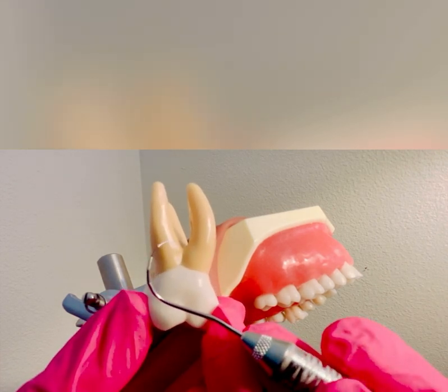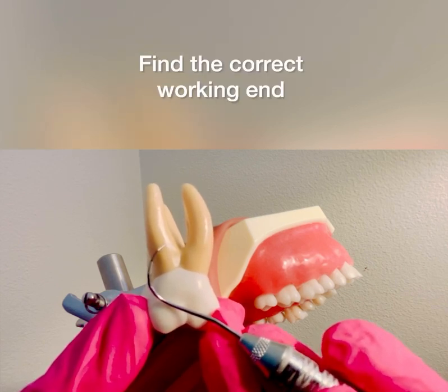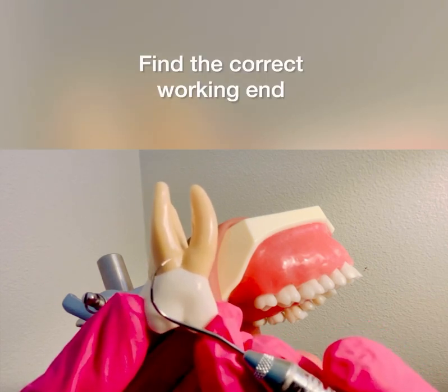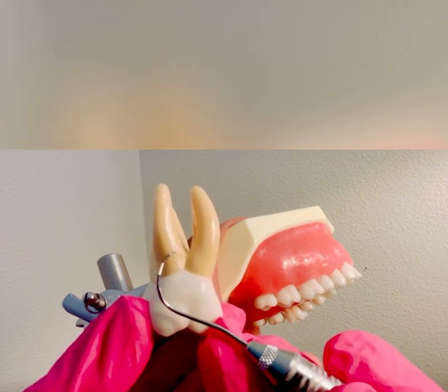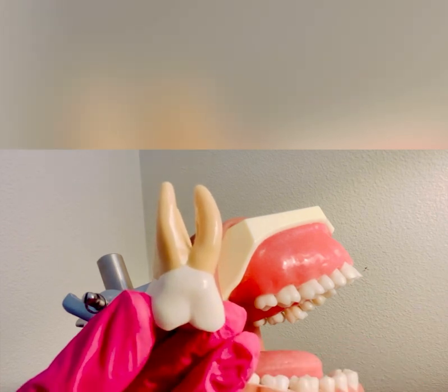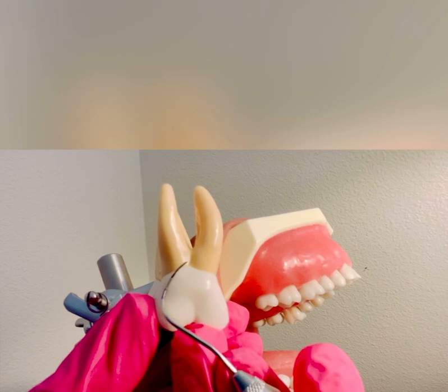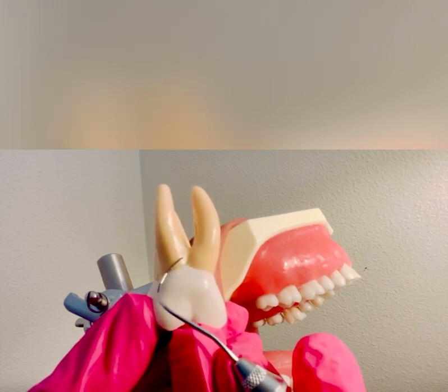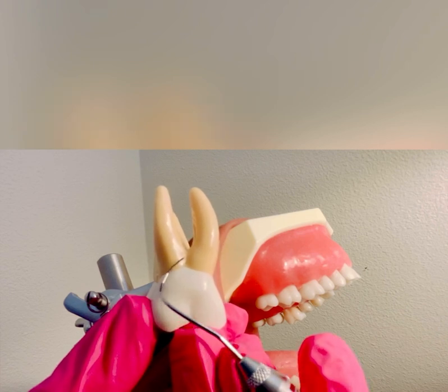To assess the furcation involvement you want to first find the correct working end. If I hold the Nabers probe against the tooth surface, you can see how the probe wraps, rolls, and hugs right into the furcation. If I flip it to the opposite end, you can see how the probe is not adapted and it's very difficult to roll into the furcation. The tip is pointing towards me, so that is the incorrect working end.